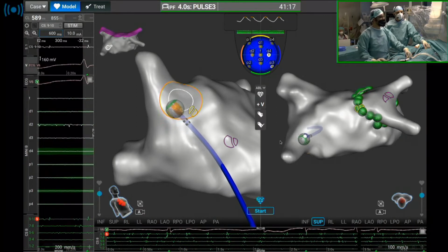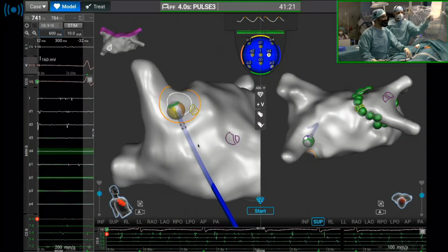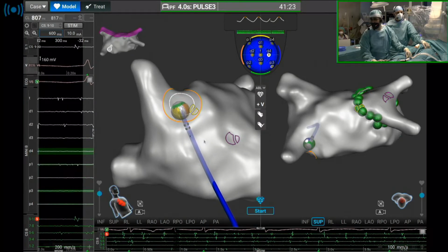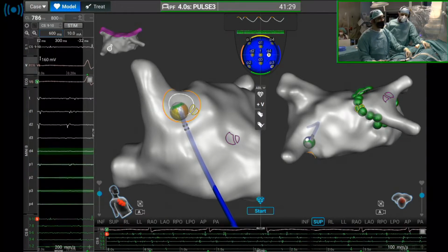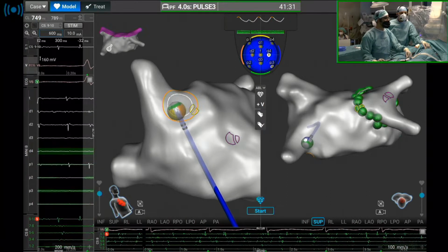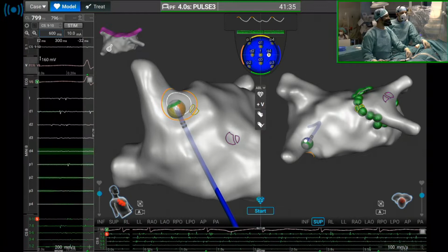So for the sake of time, maybe we can start with ablation, and we can show the electrograms prior. Now, let me see. You see on the left side the real-time. So you see the two views from the map, and you see the electrograms in live view. Now, I want to make sure that you see what happened to the electrograms immediately after ablation.